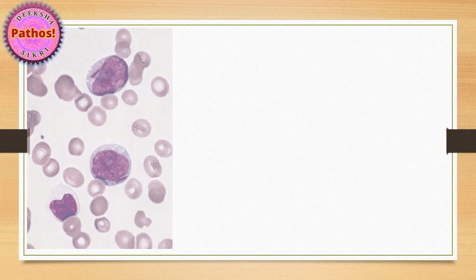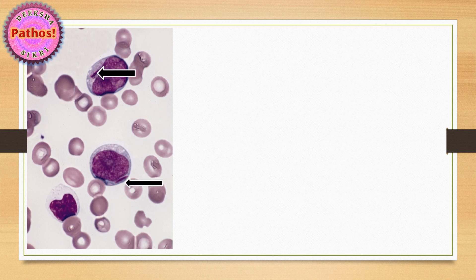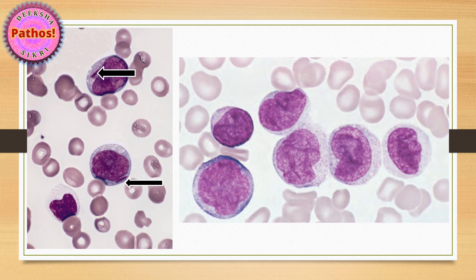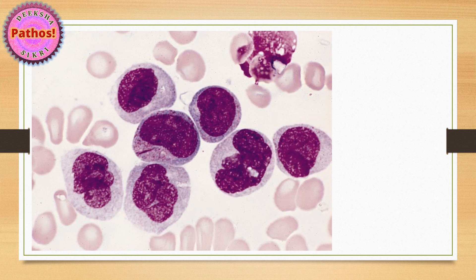The next group of tumors in which you see blasts are acute leukemias. Look at this photograph — you can see two big cells with high NC ratio. In the cytoplasm, you can recognize those classical rod-like structures called Auer rods. So these are myeloblasts. Now look at these cells — again big cells because of the nucleus, high NC ratio. The nucleus looks like it's folded upon itself, almost like kneaded dough. This folded or creased nuclear appearance is very classical of monoblasts.